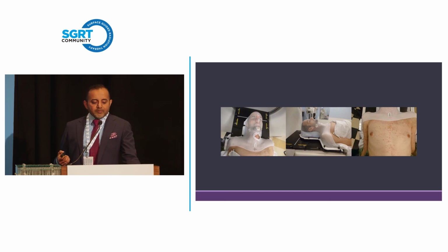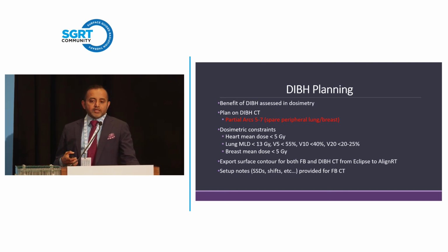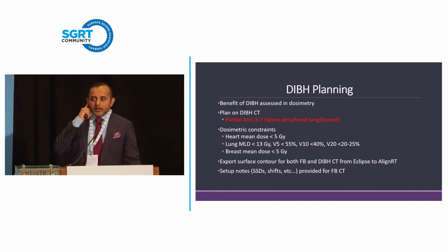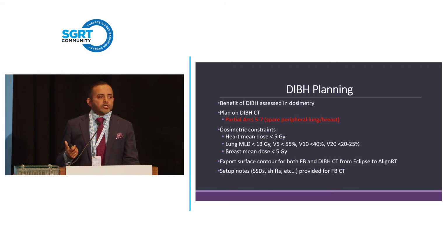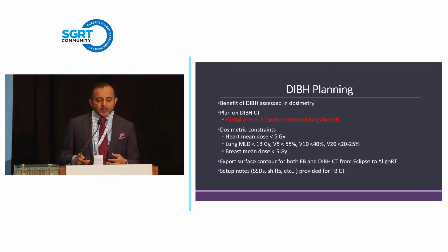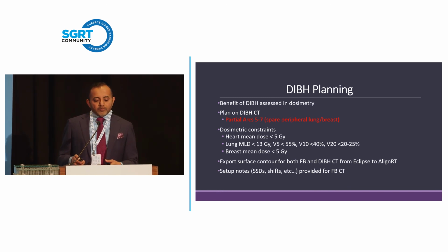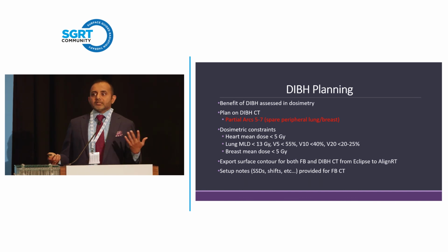In terms of planning, as I mentioned, partial arcs are typically very helpful in these patients. And for the dosimetrists in the room, really working hard to spare heart, lung, and in a young woman, breast tissue as well. So today, the average heart dose for a DIBH lymphoma patient really is on the order of 2 to 3 gray, exactly like a left-sided breast cancer patient. And the mean lung dose, we try to keep it below 13 gray. Historically, when you did APPA for a lymphoma patient, the V20 was easily 40%.